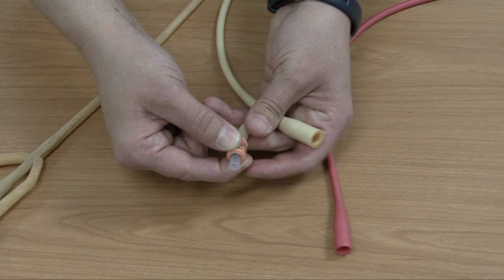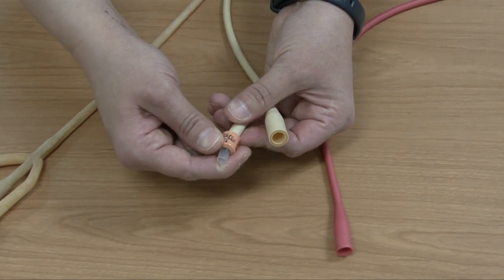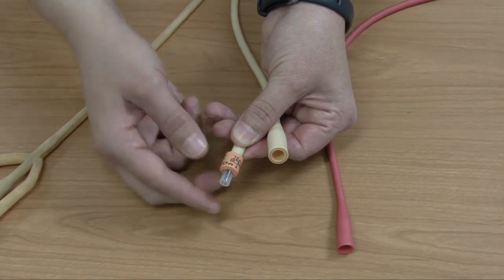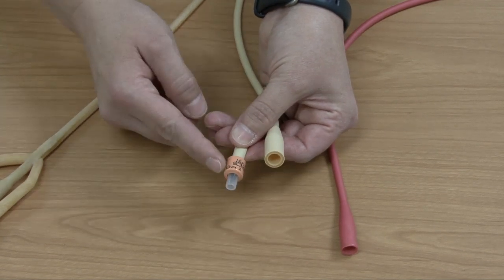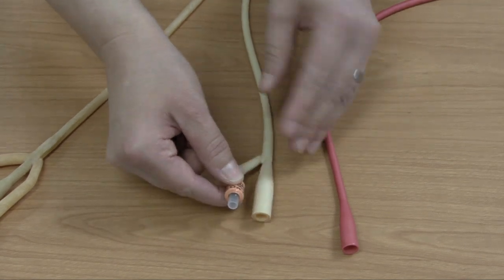It's telling you how much sterile water to inflate this balloon with, and it usually gives you the size — for example, 16 French. So this is one place you can always quickly check while the catheter is in your patient to tell the size of the catheter and how much sterile water the balloon is inflated with.